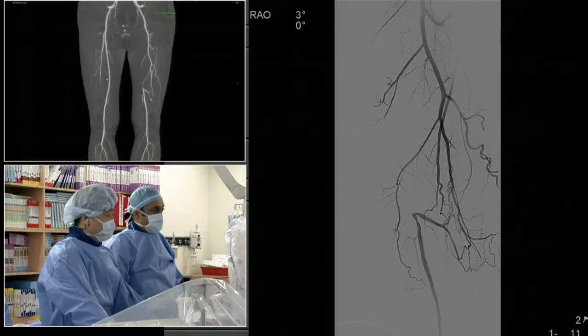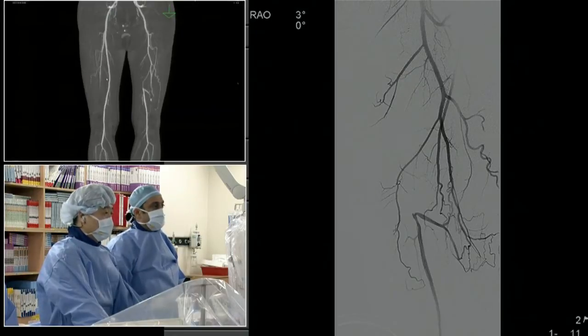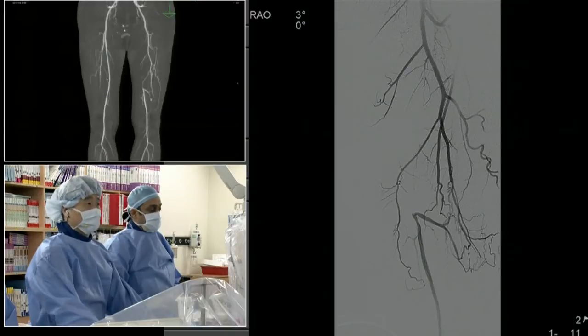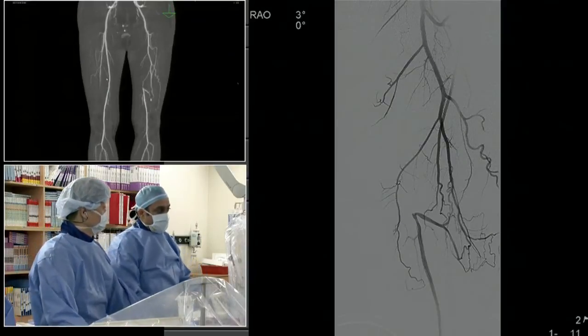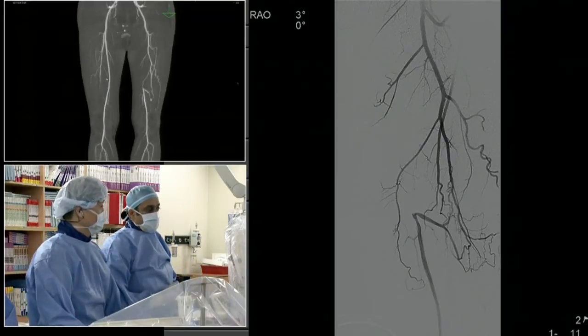Yeah, I think, you're quoting VIBRANT, and then VIPER, a single-arm study, had a better outcome, and VIASTAR better. But the challenge has always been this idea of covering these collaterals on the outflow, which is a potential problem, particularly if a failure mode is thrombotic. Yeah, and even though the trials didn't necessarily show that, to cover the distal collateral.